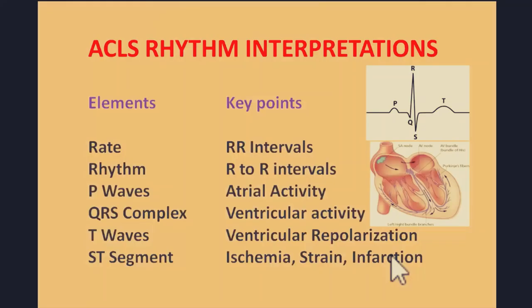and determine what kind of rhythm we are looking at, we need to have some basic understanding of what are the things we need to look for. So let us start off with the basic electrocardiographic building block, which is the PQRST complex, which is representing one heart beat.